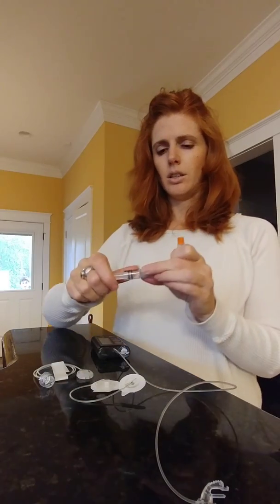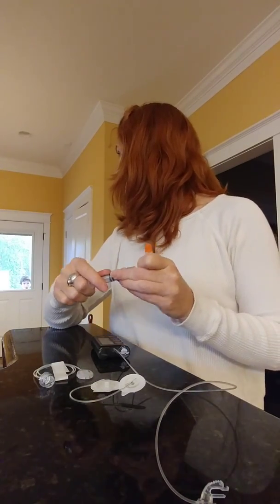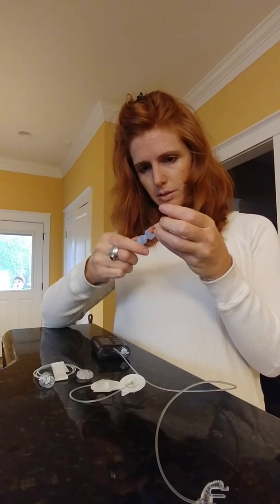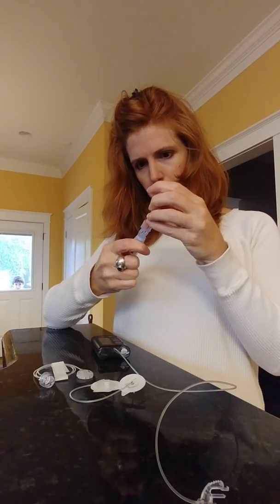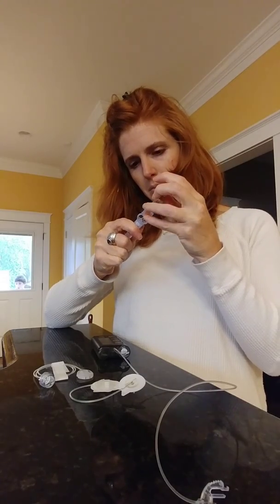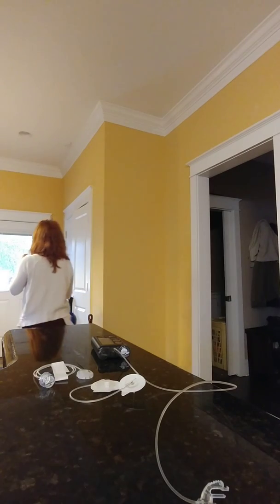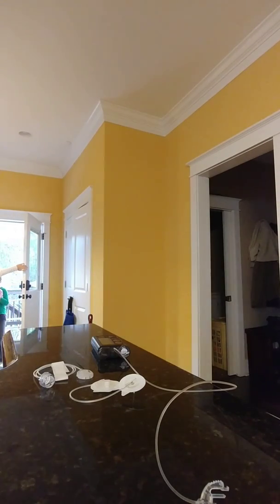And I push the plunger down a couple times so that I can easily draw the insulin. And then I use the needle to draw the insulin. I'm trying to keep my hands clean while I do your site.